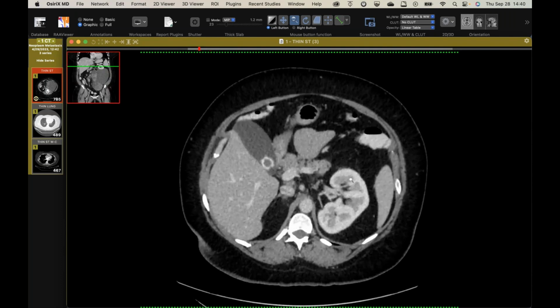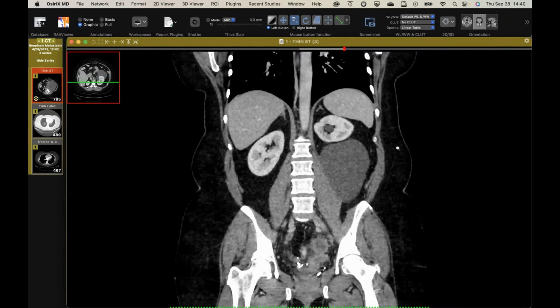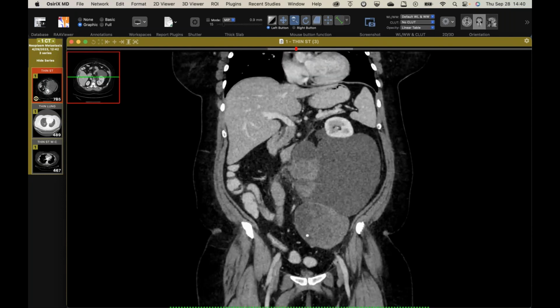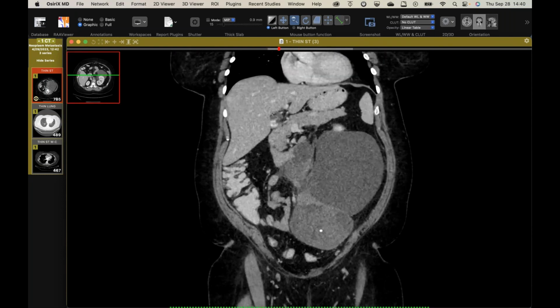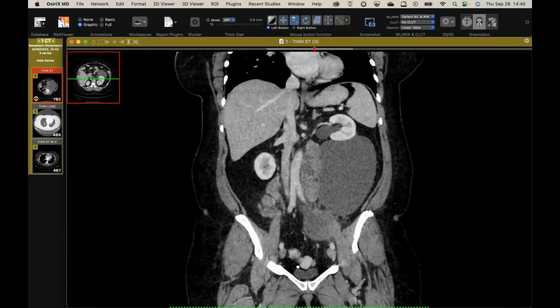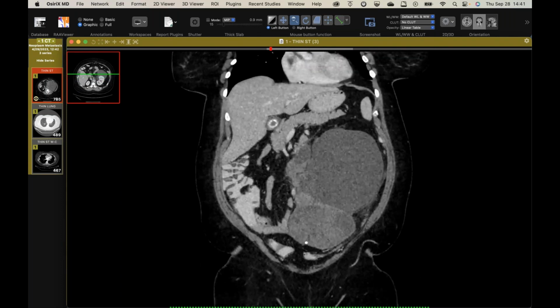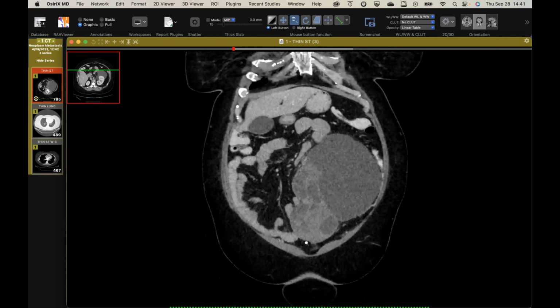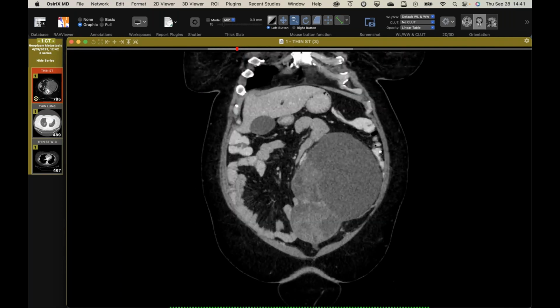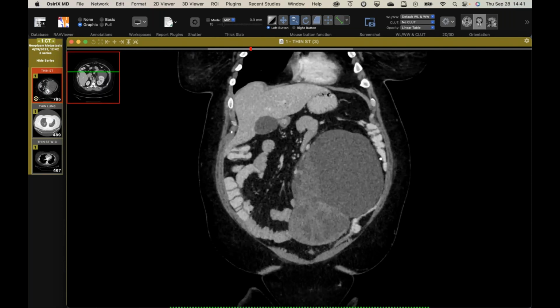Let's see if we can do a coronal here. You don't think it's retroperitoneal alongside the kidney there? Well, that part may be, yeah. I wonder if that is because it is pushing it up, but I think this is intraperitoneal here, but I may be wrong. So this, right here, it looks like it's in continuity with this mesentery here. Hmm. But yeah, and see, it's separate from the colon here. I don't know what it's separating that out, but there's a tissue plane here.